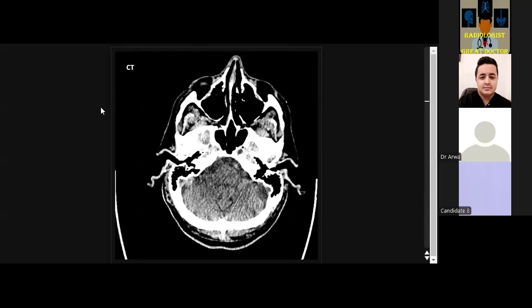Yes, sir. Okay. Ask for control, yeah, boss. This patient was found unconscious. Okay, proceed.